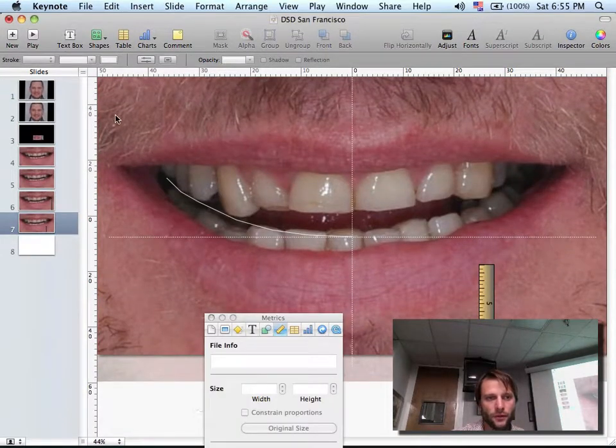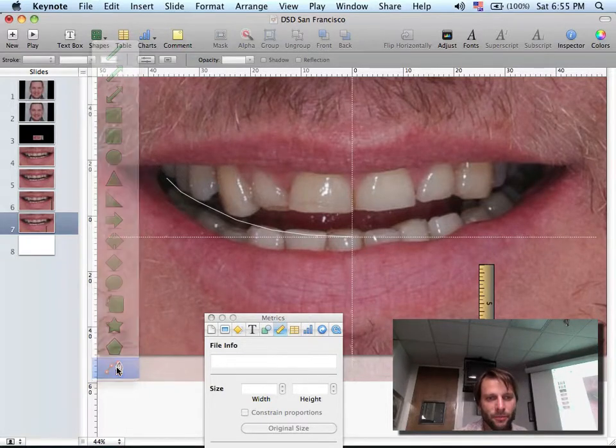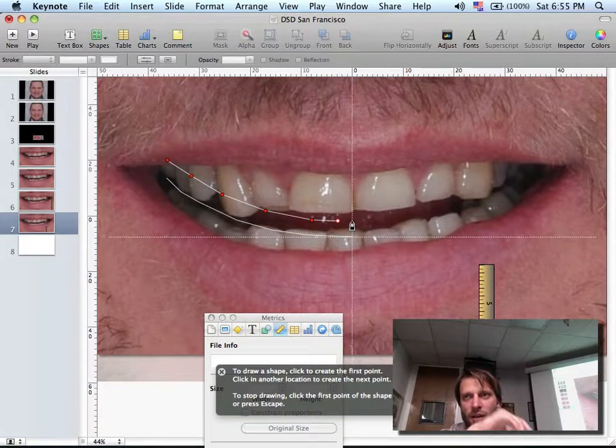To draw, you have to click shape and click this last tool, the little pen. Once you click the pen, it activates the pen, and then click by click you can create your drawing. Don't worry about making a perfect drawing at the first time. To end the drawing, you have to double click. Wherever you double click, you're going to finish the drawing.